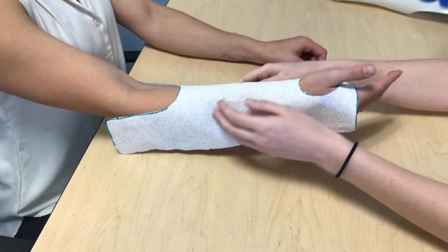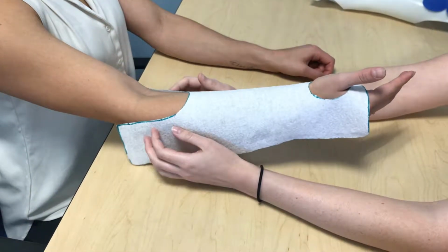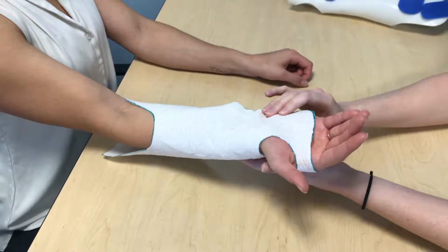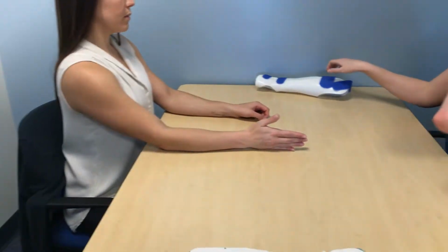And when making the pattern, we double checked to make sure that she could still have room for forearm flexion and extension, and also that there was room in the thenar eminence and that it was clearing that distal palmar crease. So the pattern looked great. So we're ready to make our orthosis.